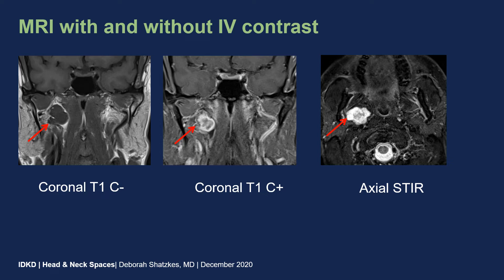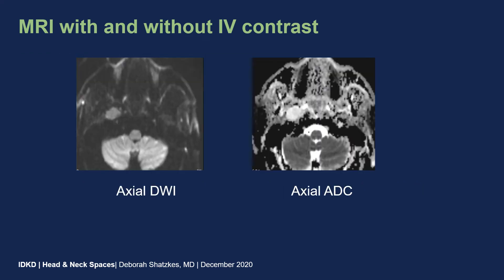The T2 signal intensity is pretty much identical to CSF surrounding the upper spinal cord. On the axial DWI image and the ADC image, we can see that the lesion does not show much diffusion restriction — it's very similar to the cerebellar hemispheres seen more posteriorly. But on the ADC map, it is very bright, kind of light bulb bright, so much brighter than the cerebellar hemispheres that it almost looks like CSF.